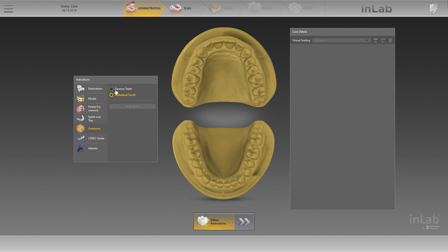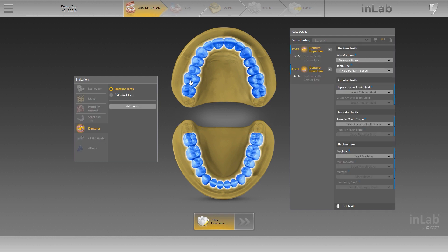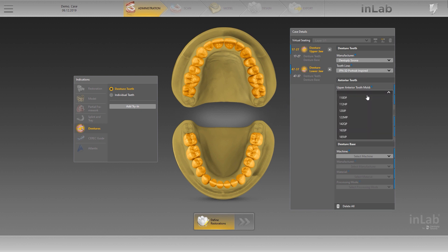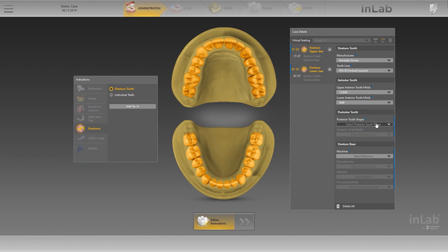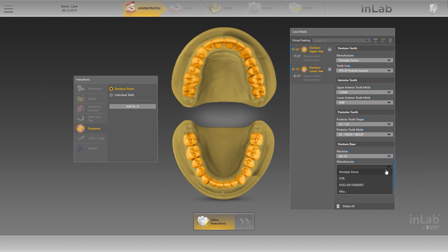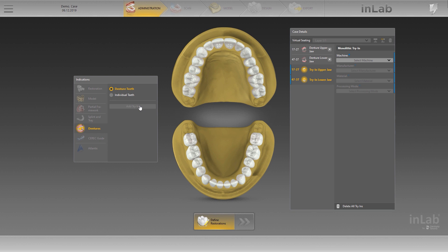If you want to manufacture your denture with pre-fabricated denture teeth, select this in the Indications menu. Teeth can be deleted or added here as well. The created denture is displayed as an upper jaw object and a lower jaw object, each consisting of denture teeth and denture base sub-objects. Next, specify the details for the denture and select the shape and mold for the anterior and posterior teeth. If you hover the mouse over a mold selection, a detailed preview image is displayed. Add a monolithic try-in if needed.